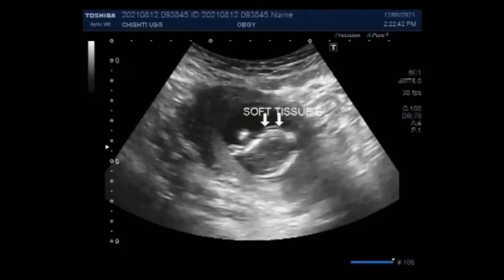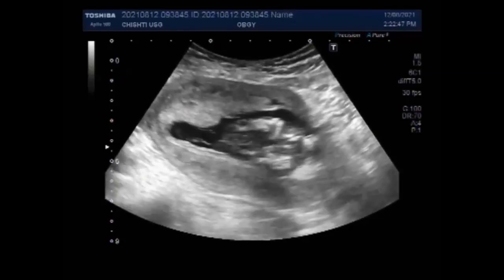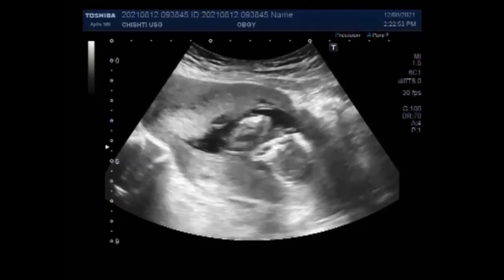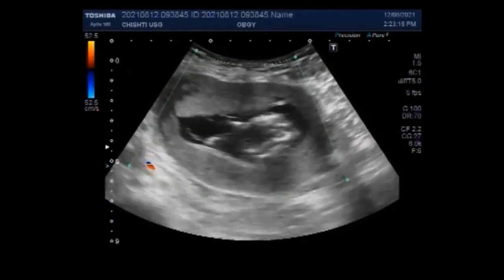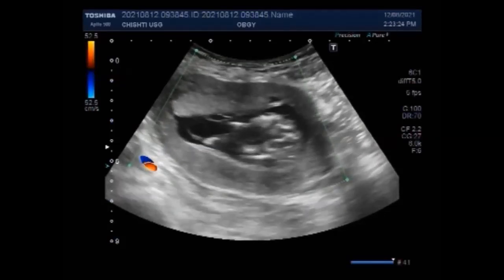Although a variety of terms are used to describe early pregnancy failure, when there is clear-cut sonographic evidence that a non-living embryo is present, the term embryonic demise should apply. Ultrasound diagnosis of miscarriage should only be considered when either a mean gestational sac diameter is equal to or more than 25 millimeter with no obvious yolk sac, or a fetal pole with a crown-rump length of equal to or more than 7 millimeter without evidence of fetal cardiac activity. Transvaginal ultrasound is the mainstay in the diagnosis of miscarriage.